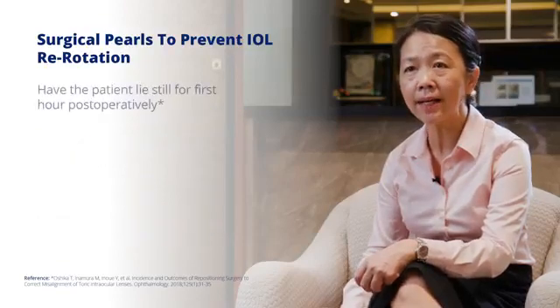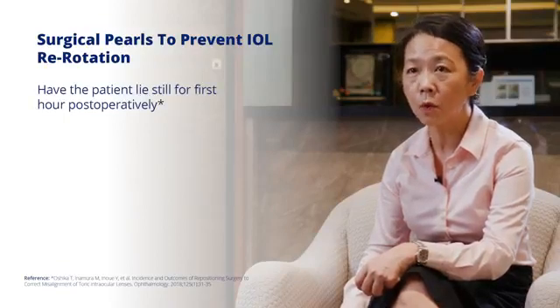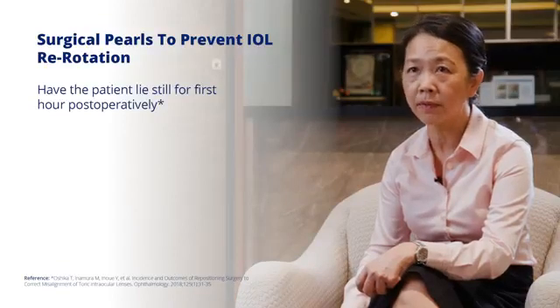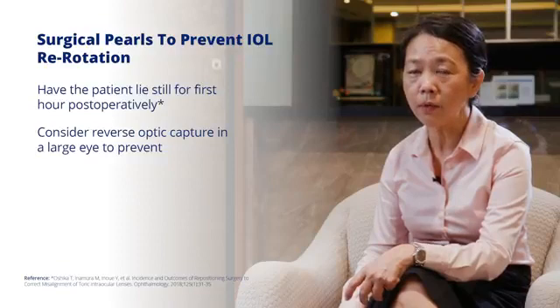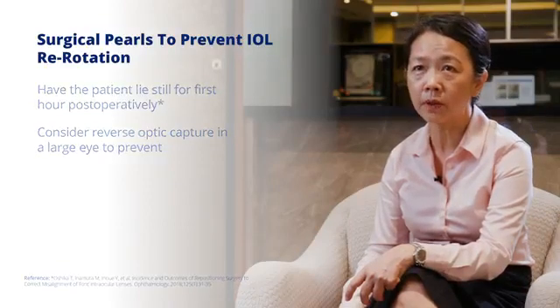Have the patient lie still for at least 1 hour post-operatively, because it is known from studies that the lens is most likely to rotate in the first hour post-operatively. If you're dealing with a large eye and you find that the lens is really freely spinning around even when you have rotated it, consider reverse optic capture.